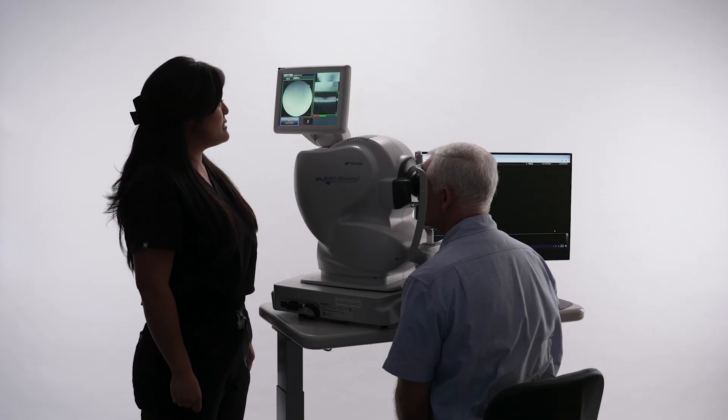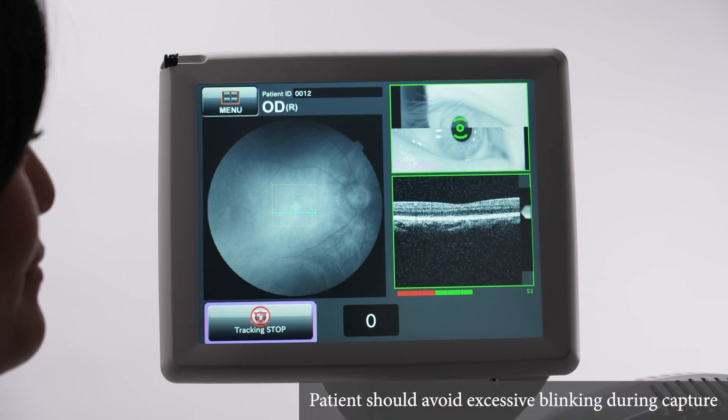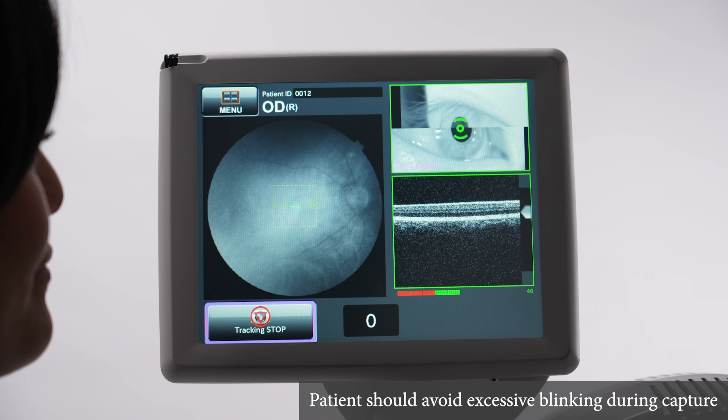On 3, instruct the patient to take a couple of big blinks, then stare at the green fixation target so their eye is wide open when the timer reaches zero. Ensure the patient maintains steady fixation on the green target until the image capture is fully completed.